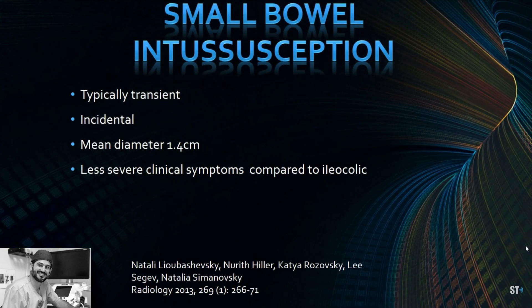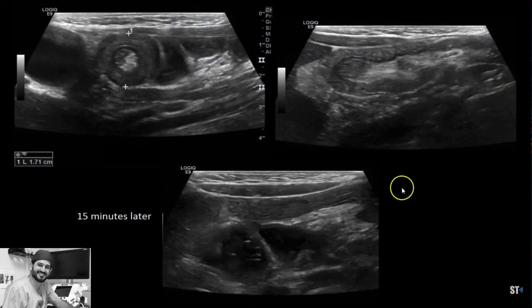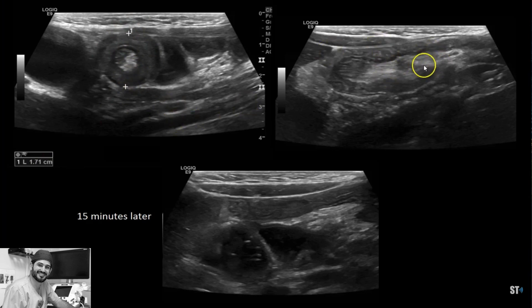Small bowel intussusception is typically transient and an incidental finding — you might order an ultrasound for an appendix and notice a small intussusception-like lesion, usually not in the right upper or right lower quadrant where the ileocolic type usually is. They're smaller than large bowel intussusceptions; the mean diameter is about 1.4 centimeters. Here's an eight-year-old girl with one in the right upper quadrant — you can see the gallbladder and this intussusception as a target-like lesion, measuring 1.7 centimeters, which is relatively small.